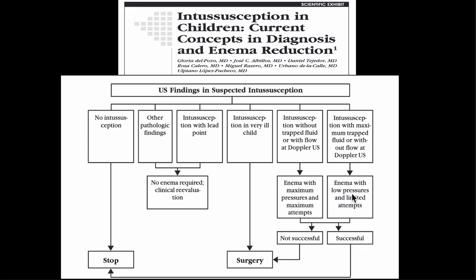However, among all these procedures which the article discusses, ultrasound guided is one of the preferred due to absence of radiation involved and the ease of real-time monitoring of the reduction happening, as we saw in our case, and also evaluation of complications. Like if there is a sudden loss of fluid surrounding the intussusception area, but there is sudden appearance of fluid in the abdomen or in the pouch of Douglas or in the pelvis, then it suggests that there is a bowel perforation.